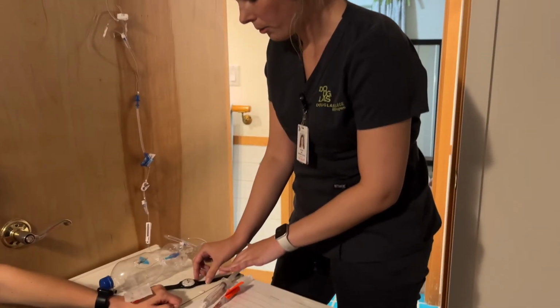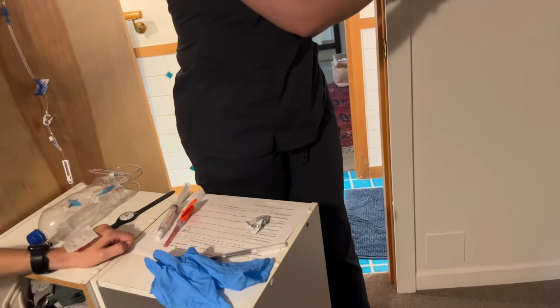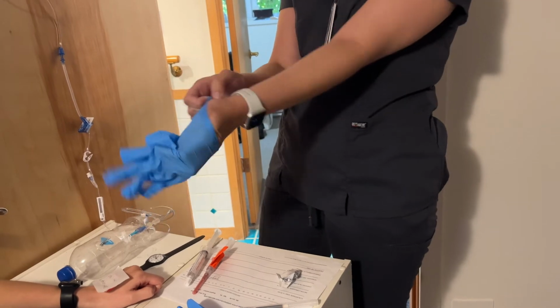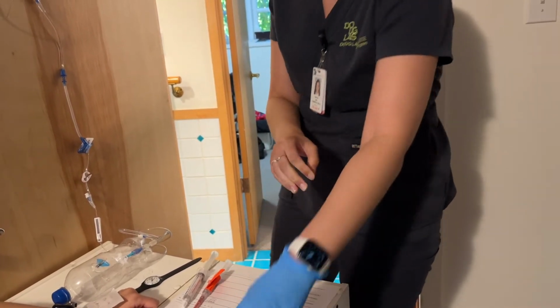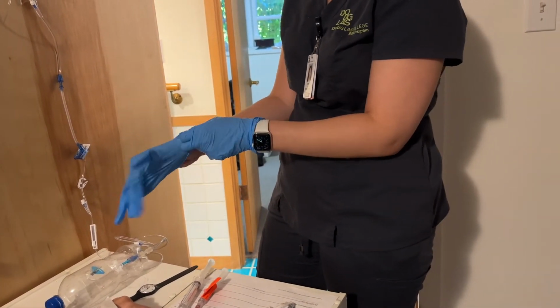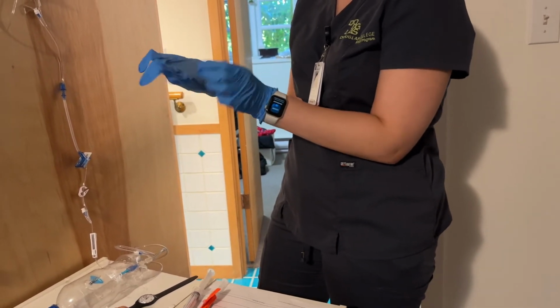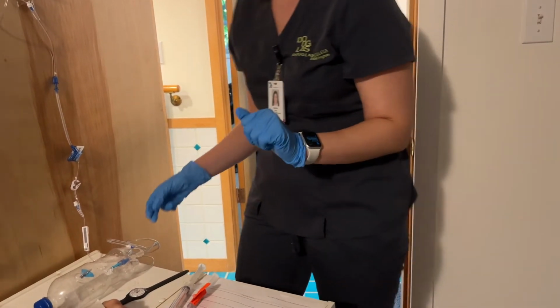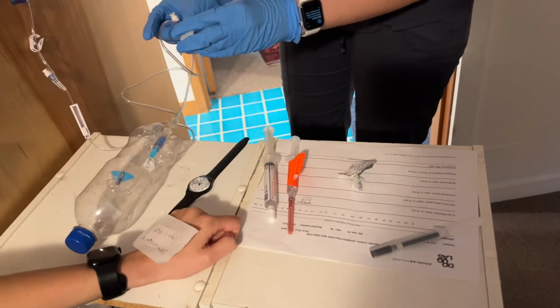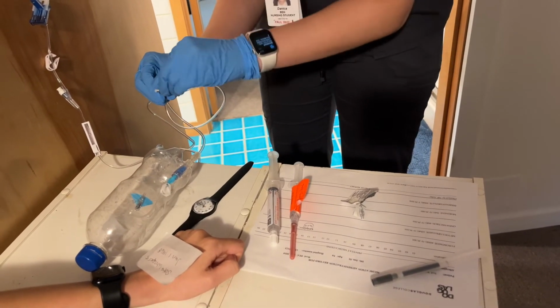Just gonna get my equipment ready, and I'm gonna pause the IV, and I'm gonna do hand hygiene, and then I'm gonna put on my gloves. Okay, so I'm gonna open up my alcohol swab and get this out and clamp it like this, and alcohol swab.